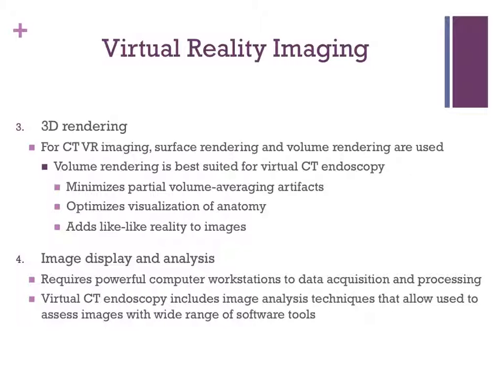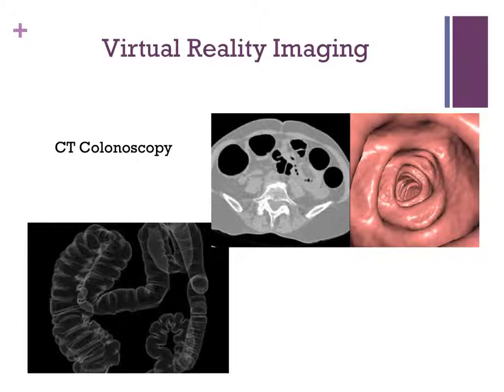In the image display and analysis step, this requires powerful computer workstations to handle the data acquisition and the advanced visualization processing operations. Virtual CT endoscopy includes image analysis techniques that allow the user to assess images with a wide range of software tools. These pictures are an example of images generated from 3D colonoscopy exams.